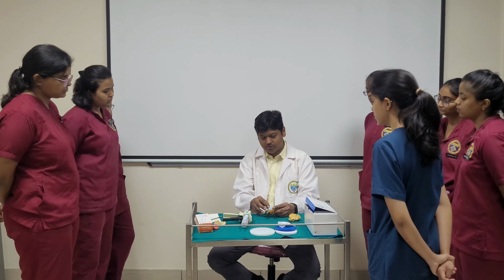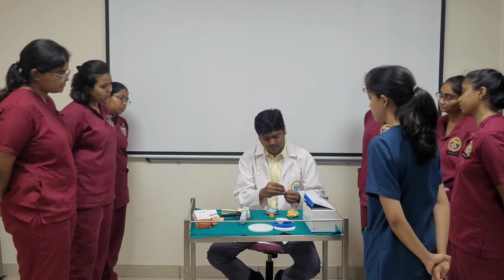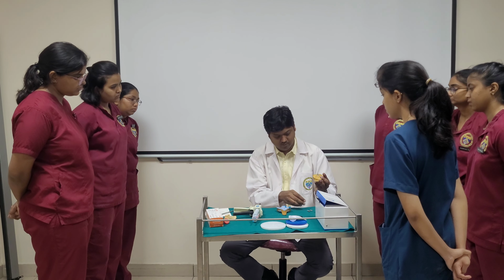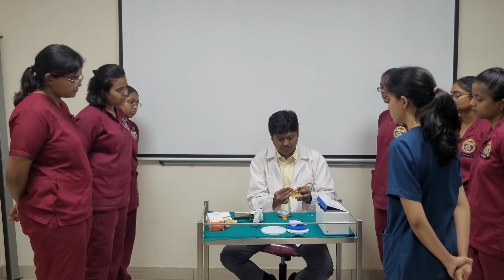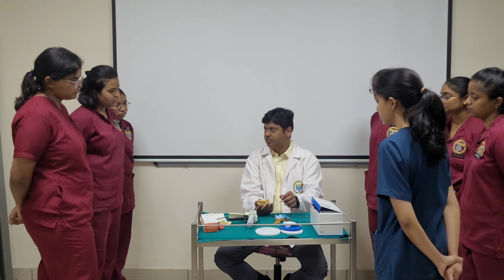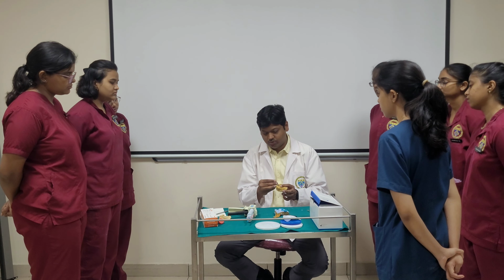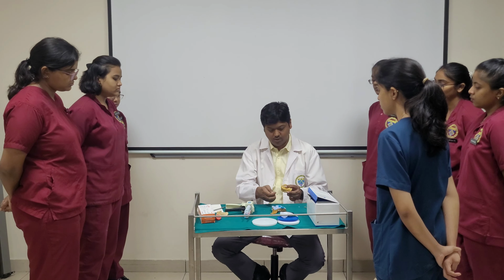Once the stone is set, the impression is taken out. How will your impression be? You will get the impression something like this. After the stone is set, you get the model like this. The analog that I had put will be inside the model, and this will be protruding outside, and then take this out from the model.